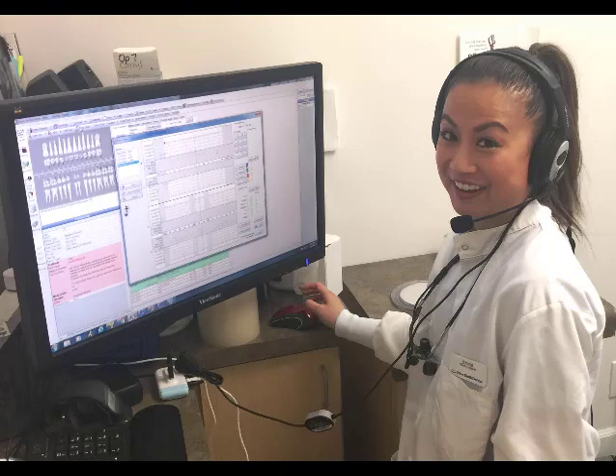So you get the idea — this works. You may have to play with it just a little bit, but it can save you an incredible amount of time. It also lets you educate patients at the same time about their pocket depths. You can tell it to stop listening, say 'that was a six millimeter pocket, and this is what that means,' and then say start listening again and go on with your pocket markings.